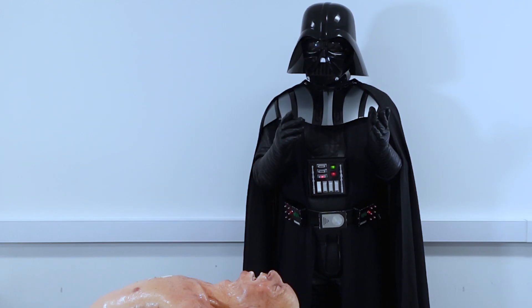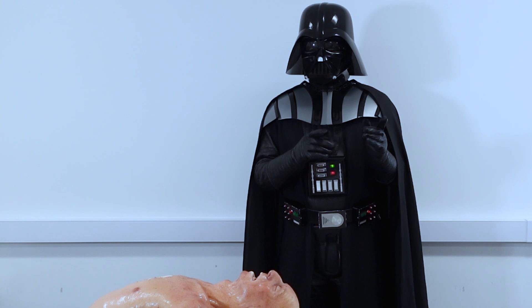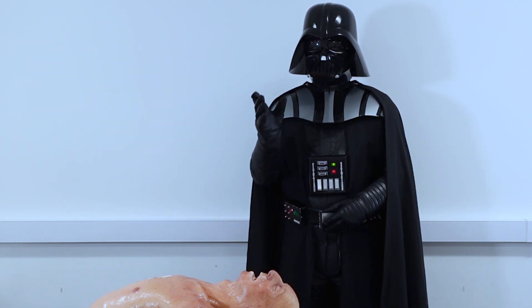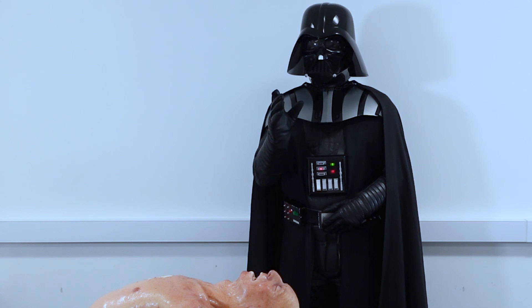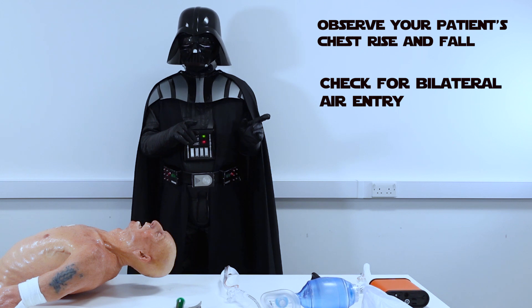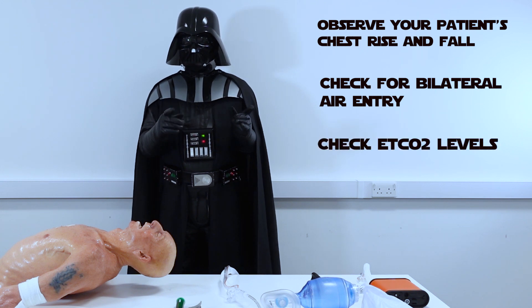Before you start fiddling with the machine itself, make sure that your patient is properly ventilated. I've seen too many patients struggling for breath whilst a lead clinician was trying to set the ventilator. Observe your patient's chest rise and fall, auscultate the chest for bilateral entry and check the ETCO2.